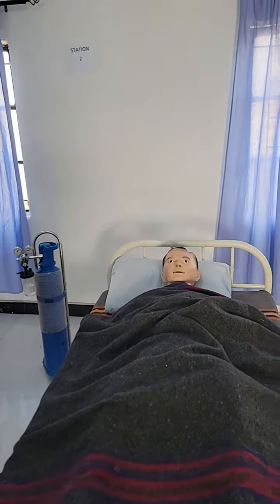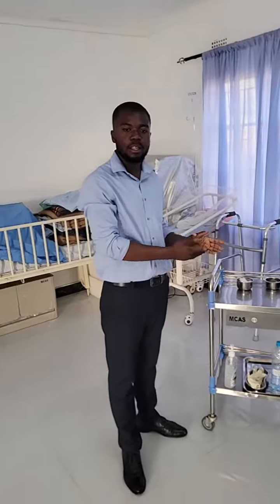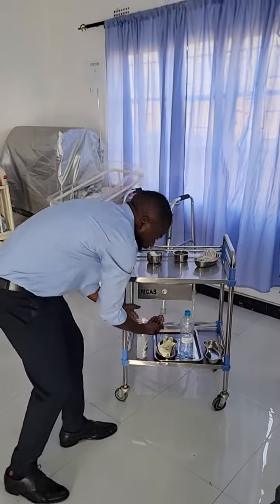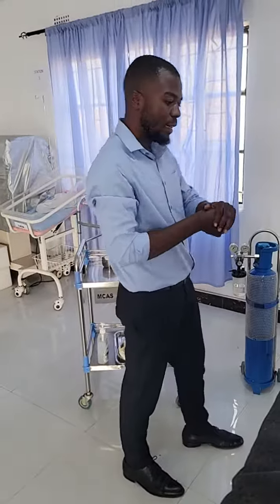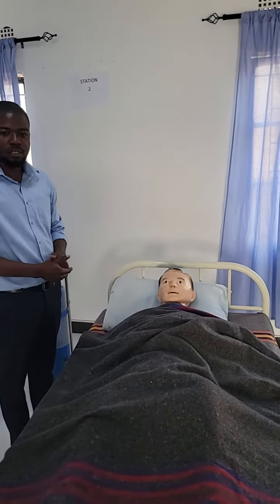First thing first, remember, before we start, this procedure is not a sterile procedure but a clean procedure. So oxygen administration is a clean procedure. Wash hands and dry them. For all the procedures, wash hands first and dry them with your towel. Then you go to the client or the patient to get permission.